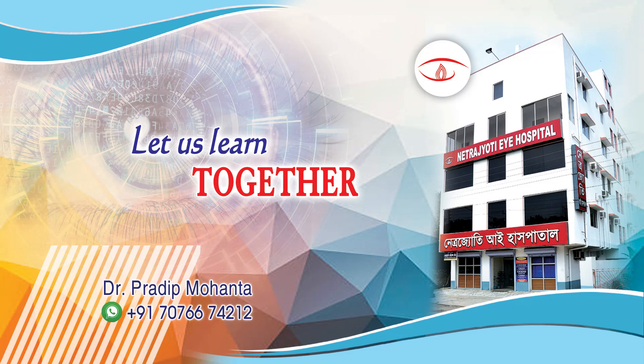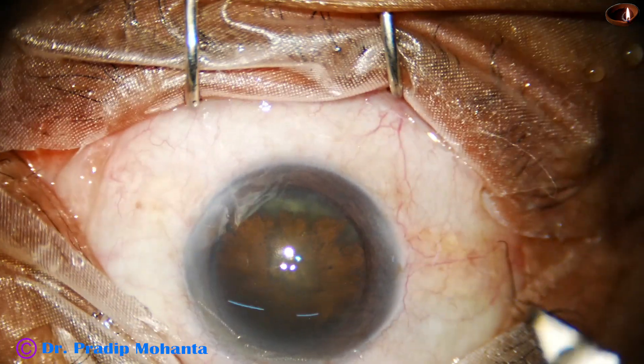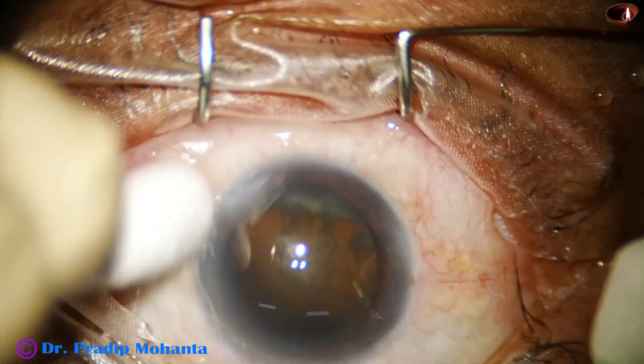Friends, welcome to my workplace at Ranakart, West Bengal, India. In this video, we are going to see the management of this soft cataract and hydro polish.